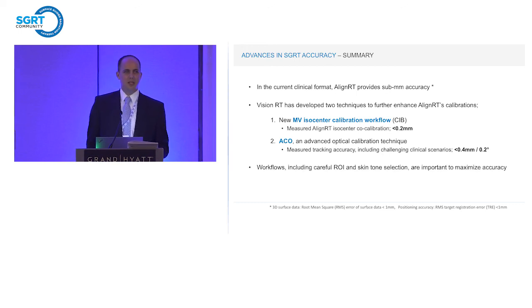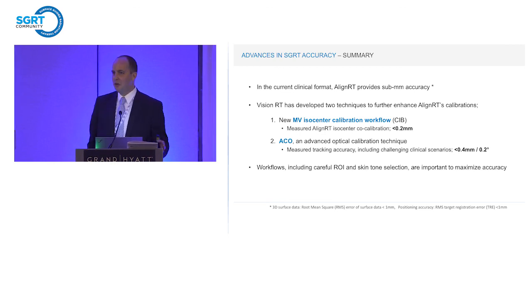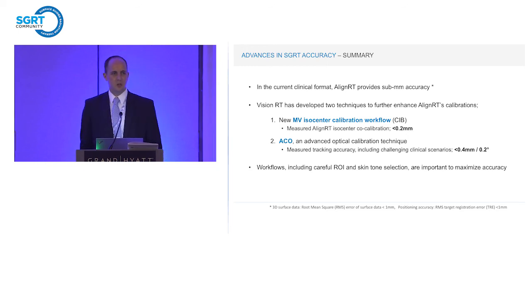Just the very bottom line, calibration is essential. If you have a poor system calibration, it doesn't matter how good your ROI is, it doesn't matter anything else. You have to have a good calibration. But once you have that good calibration, we still have to pay a lot of attention, as we know, to other workflow-related issues, such as carefully selecting a good region of interest, good skin tone selection, things like that. So I haven't talked about that here today, but we still obviously have to make sure that we get the full package for the treatment to get the best accuracy that we can.